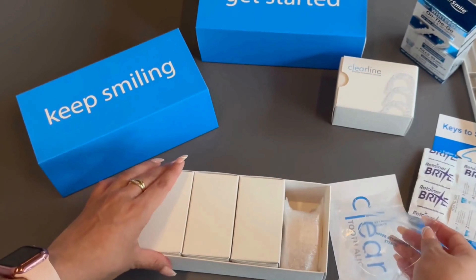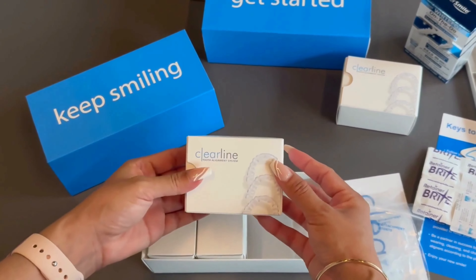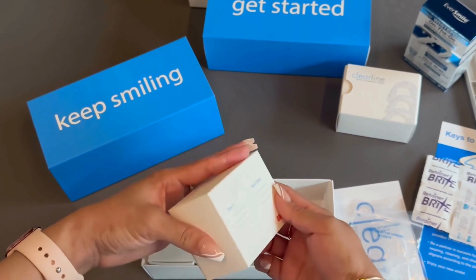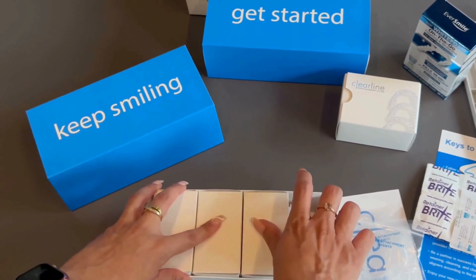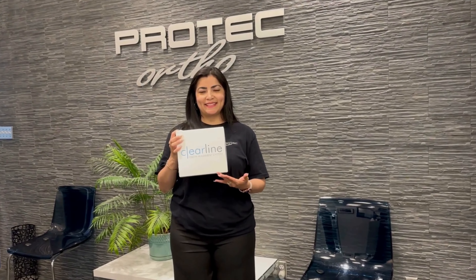The next three boxes, containing three upper and lower aligners each, are to be handed out to the patient at your discretion. We recommend roughly one month intervals between each box of three aligners. All remaining stages of treatment will be shipped to you in the Keep Smiling box only.